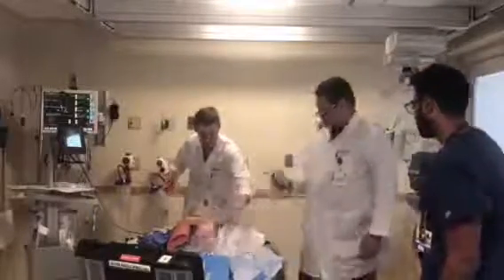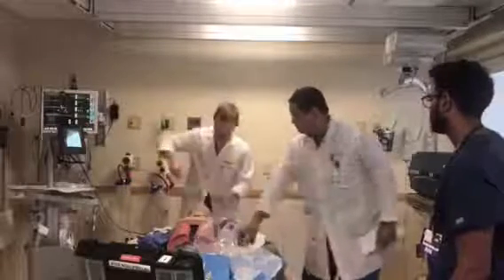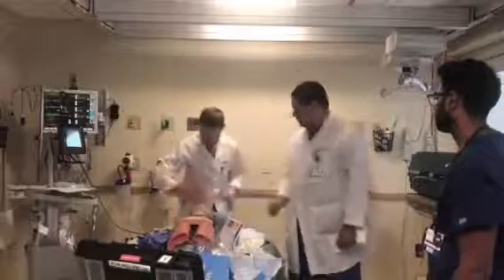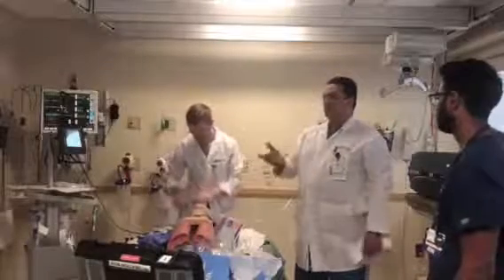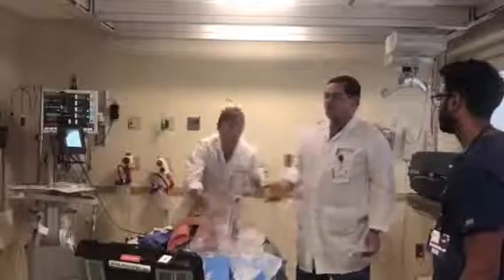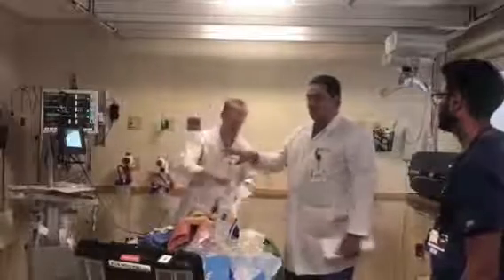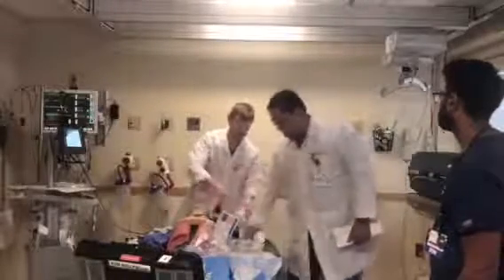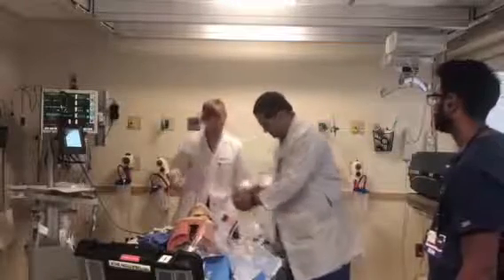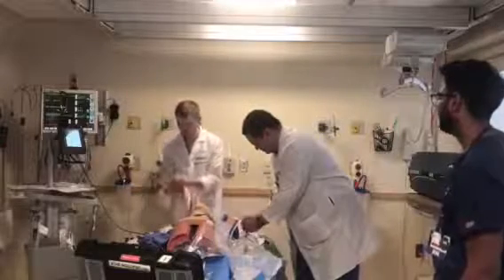So you don't have to put your nails anywhere. Just put it the usual way. Hold it like this. Yeah. That's it. See? Anybody can do it. Even if you've never done it before, just take this thing and put it, and you save somebody's life. You know, there's no privileges to do this, by the way. You don't need privileges to do it to save somebody's life as a good Samaritan, right? We're not good Samaritans. We're Bractonians.